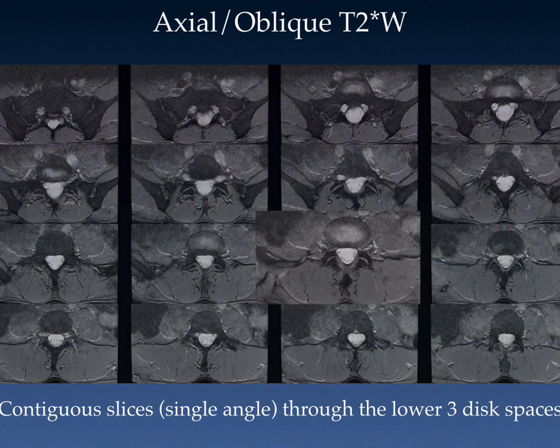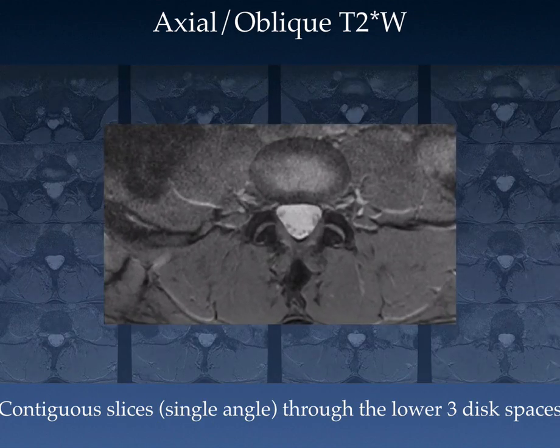As you can see, we've got good contrast between the posterior intervertebral disc and the CSF. You can see the nerve roots quite well, as well as the ligamentum flavum and the facet joints.